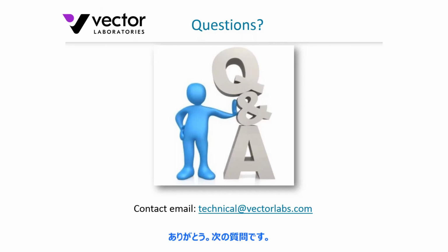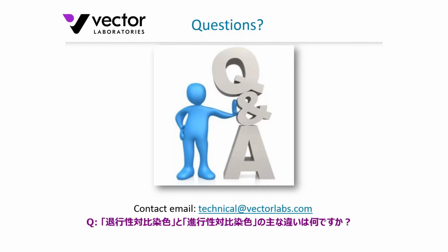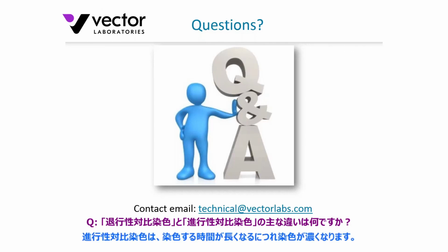The next question is, what are the major differences between regressive and progressive counterstains? Yeah, progressive stain tends to be, the longer you leave it in there, this is painting with a very broad brush, the deeper stain you will get. And I'll refer back to the couple of sections I showed of breast carcinoma, whereby the very heavy or robust staining we showed in the image on the left was a hematoxylin progressive stain that had been left in there for a considerable period of time.